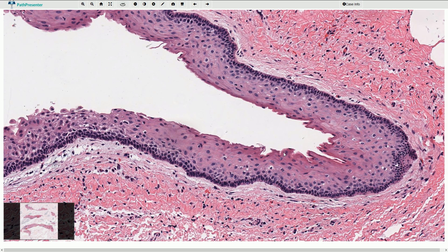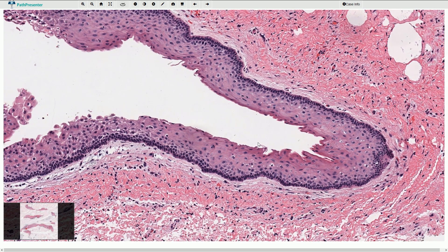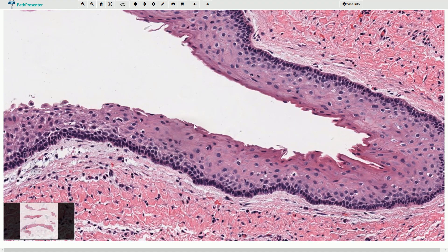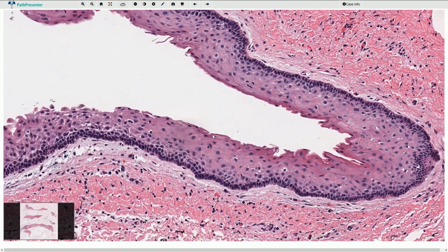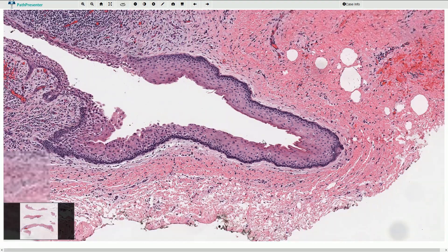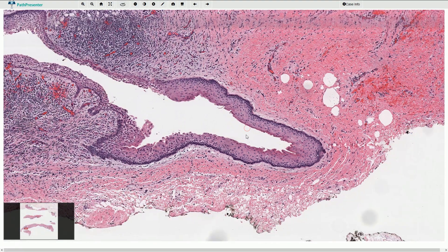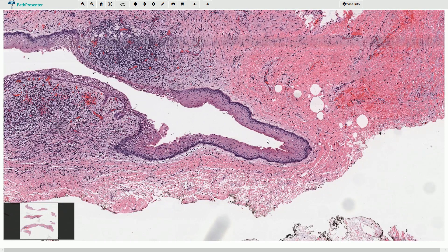Parakeratosis means that we have pyknotic nuclei retained in the superficial layer of keratinocytes. But the appearance of this parakeratosis is quite specific. We can find some pyknotic nuclei here and there, but the overall appearance is different than in typical parakeratosis in the epidermis. A quite useful sign is when we look at it on lower magnification — it looks like someone took a purple marker and drew a line on the surface of the epithelium, and the line is slightly wavy or corrugated. That is another important feature.